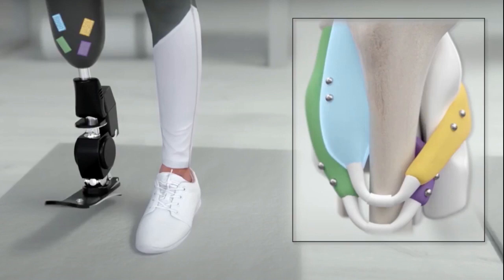They also compared their data to measurements taken using a more traditional approach known as fluoromicrometry, a type of X-ray technology that requires much larger equipment than magnetomicrometry. The magnetomicrometry measurements varied from those generated by fluoromicrometry by less than a millimeter on average. The researchers say that they are able to provide the muscle length tracking functionality of the room-sized X-ray equipment using a much smaller portable package, and they are able to collect the data continuously instead of being limited to the 10-second burst that fluoromicrometry is limited to.